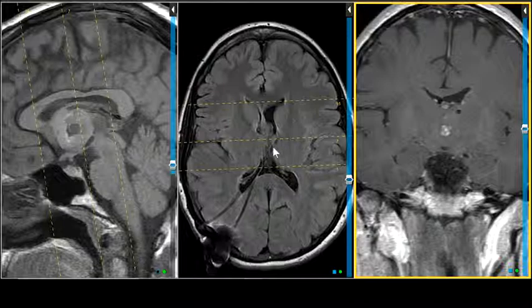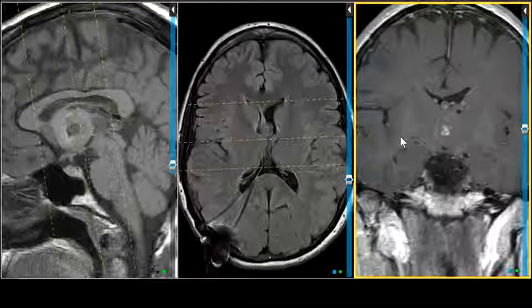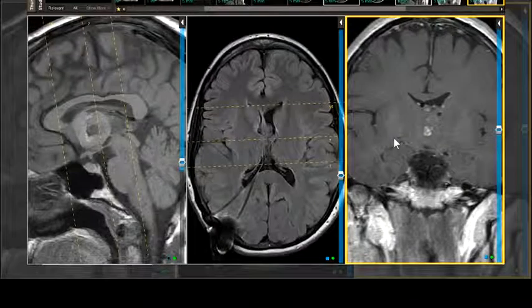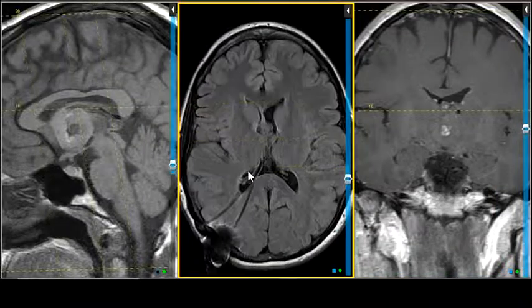Now, there might still be some holes out here, but probably was not working quite as well as it needed to. Mind if I put a little dot on the tip right over here, just so everybody can see it? Right. There. There's the tip of one of the shunts in the wrong place. Hang on, let me just close that out for you. Go ahead. Okay, so we got another shunt tube.